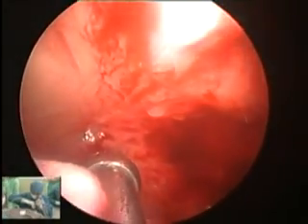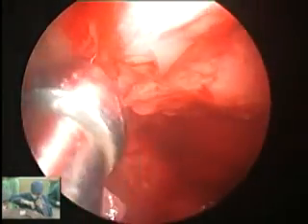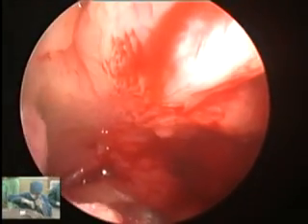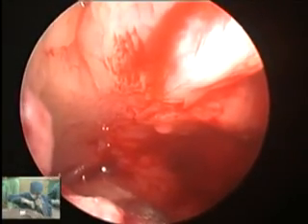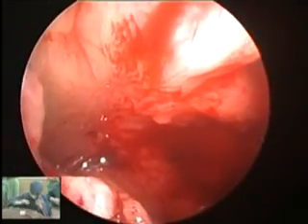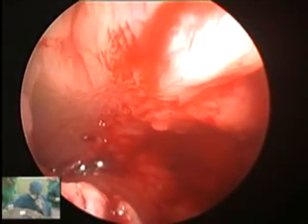You can just see the beginning of the ostium there. If you change to a 45 or a 70, we'll be able to visualize the ostium. The opening is there. Yes, we see it. Do you think it's slightly more laterally receded than the normal ostium? That's right. Because normally with the 0 degree, we should be able to see it at least, maybe just see it. 30 degree, most of the time we can see it.